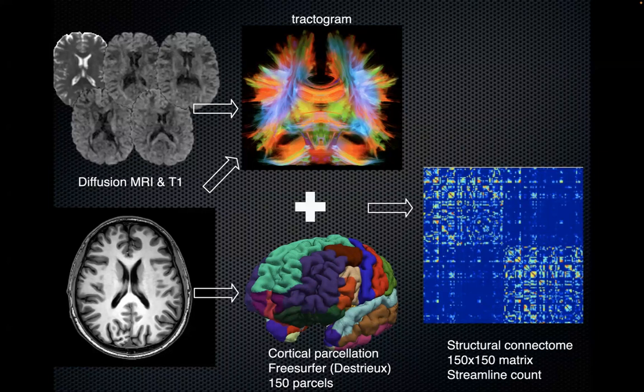And the connectomes, because we don't build only the FA connectome, you can basically build the connectome for every pixel measure that I presented today. So not just streamline count or track count, but axial diffusivity, extracellular space. You can even put lesions in there. So it's really a pipeline to handle connectomics data.